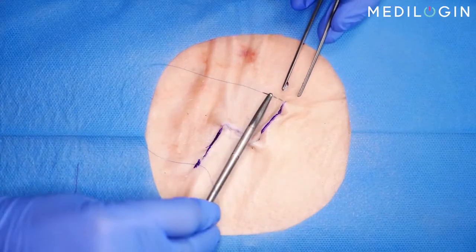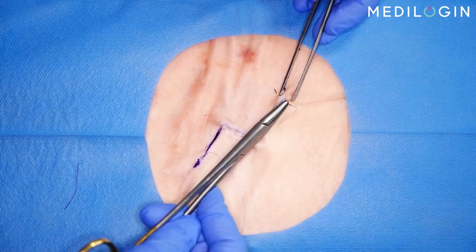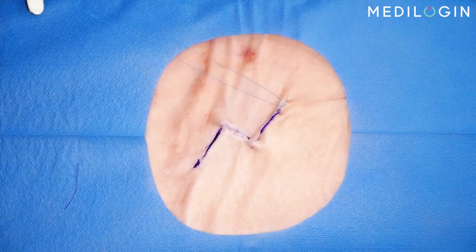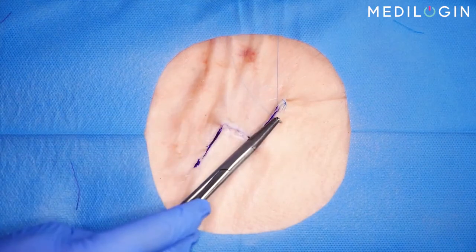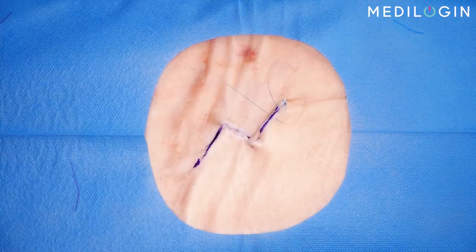After the flap has been completed and subcutaneously sutured, the skin suture is performed. In this case, we implement a continuous suture. We use a continuous suture here because the wound is tension-free and the suturing process is much faster than, for example, using simple interrupted sutures.